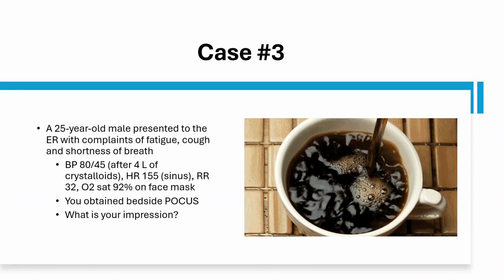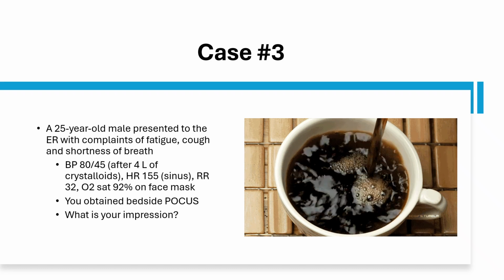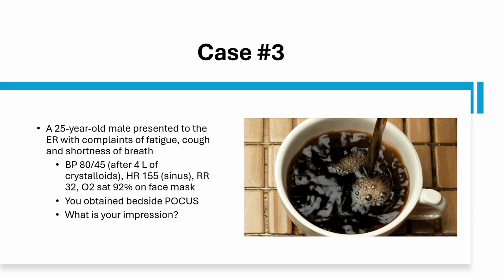Let's go on to review the images for the third patient, who again is the same patient but with different pathology and ultrasound findings. So let's review and see what our patient number 3 has. First, you have this parasternal long axis view. Again, take a moment to understand what's going on there. Here you see that the LV is decompressed, underfilled, and being squished by a dilated and dysfunctional right ventricle.